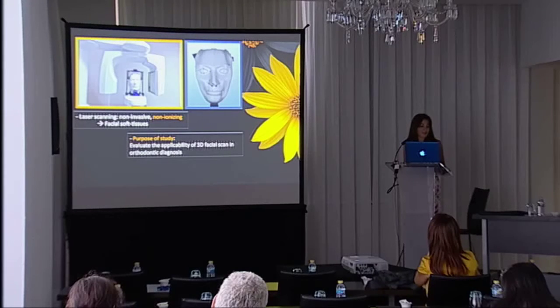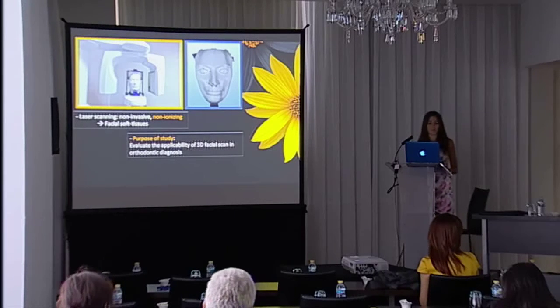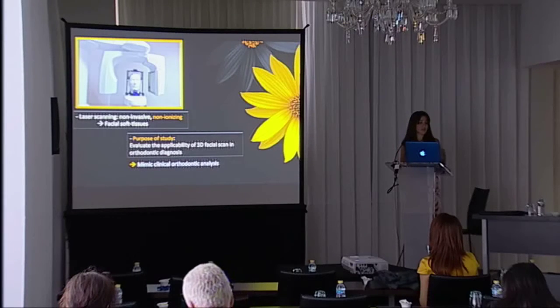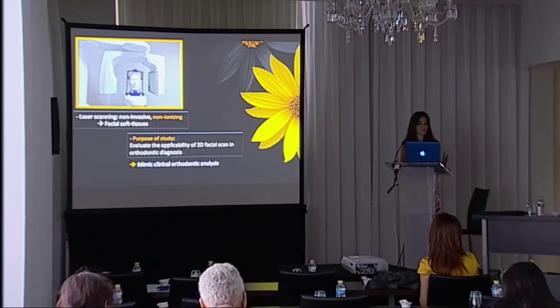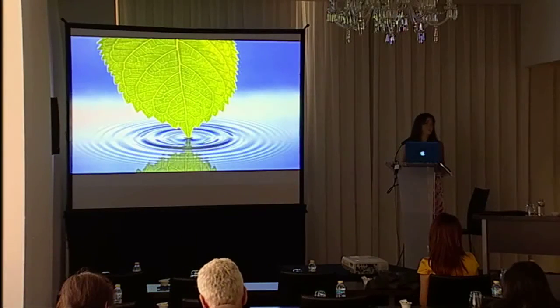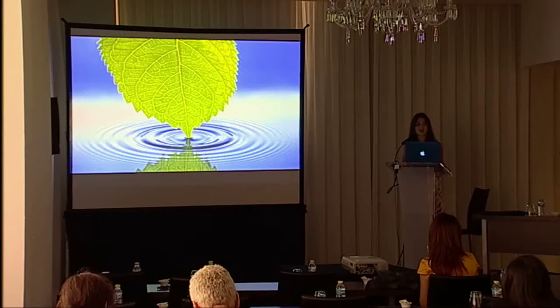The aim of our study was to evaluate the applicability of the 3D facial scanning in orthodontic diagnosis, thus to try and mimic as much as possible the clinical orthodontic analysis. In our study, we compared the 3D facial scans to the classical 2D photographs that are usually taken for orthodontic analysis.